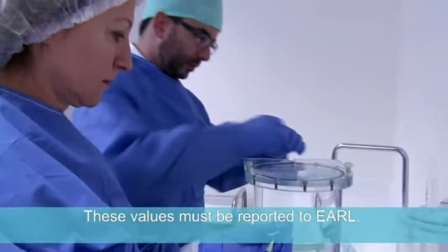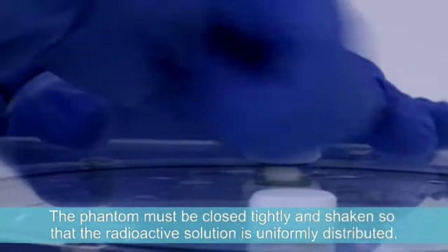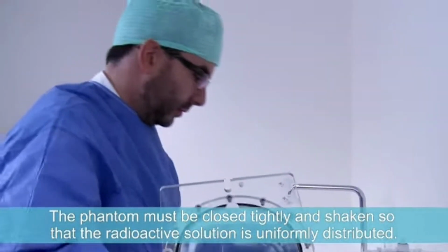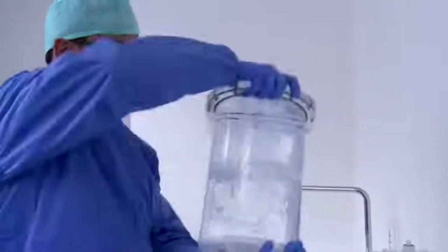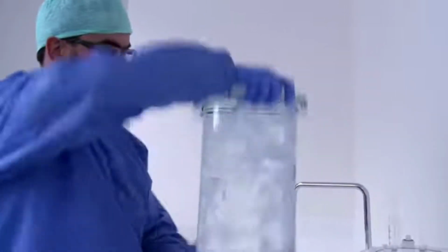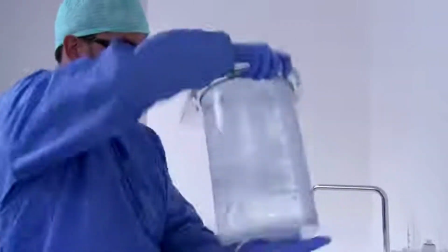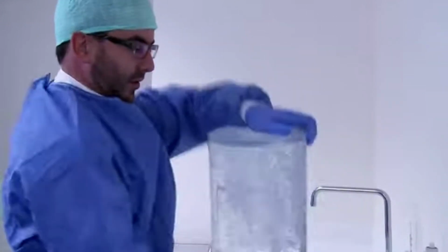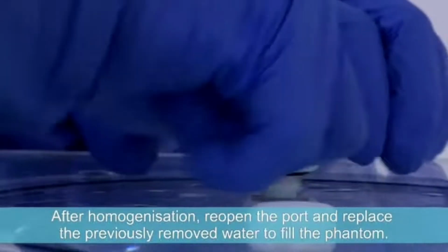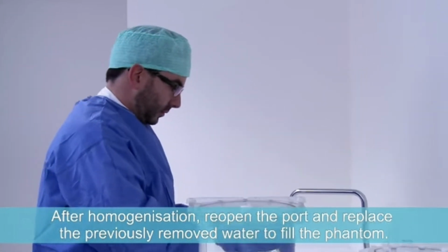These values must be reported to EARL. The phantom must be closed tightly and shaken so the radioactive solution is uniformly distributed. After homogenization, reopen the port and replace the previously removed water to fill the phantom.